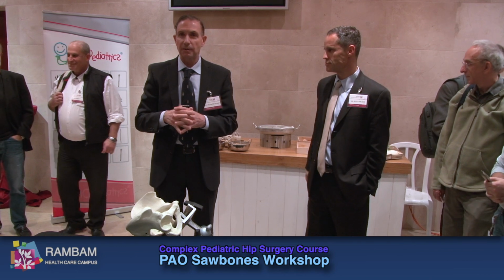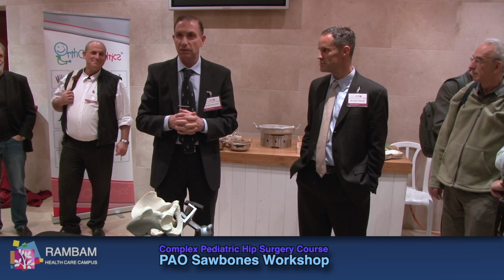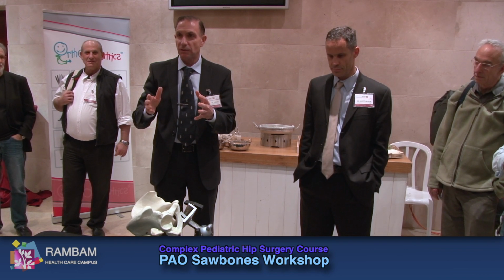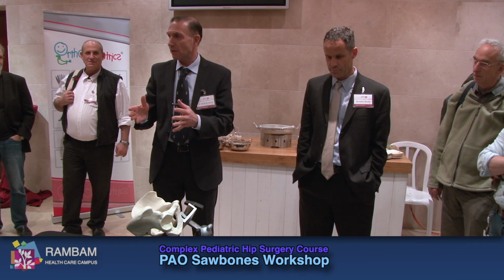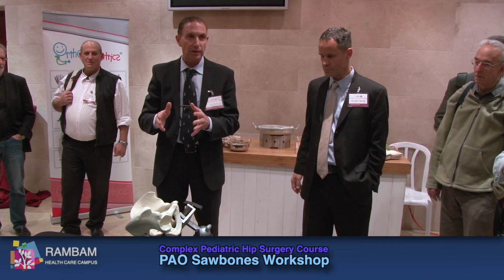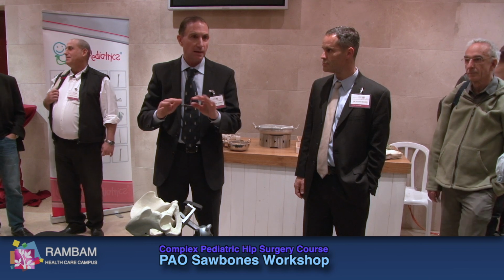There's no study looking at improved outcomes from doing a minimally invasive procedure. You need to see what you're doing with this osteotome, because this is looking at preserving a joint for as far as possible the lifetime of the patient, for as long as possible. So you need to get this operation right. How big an incision you need is as big as you need.